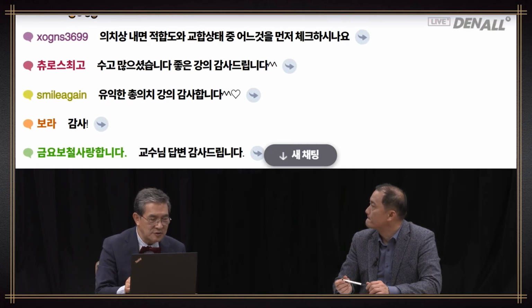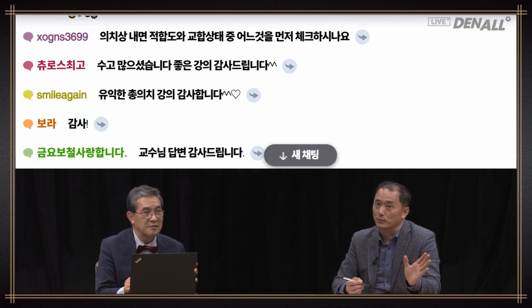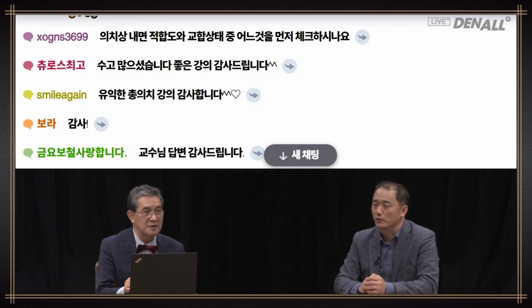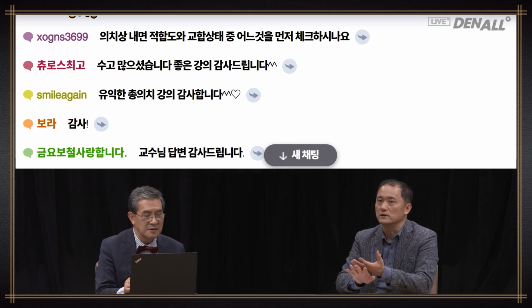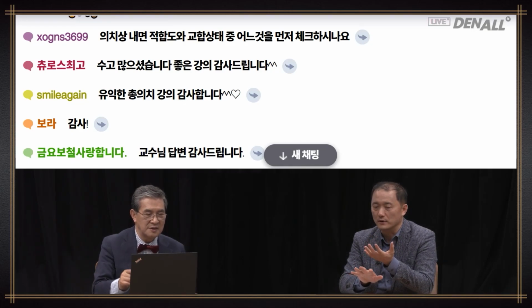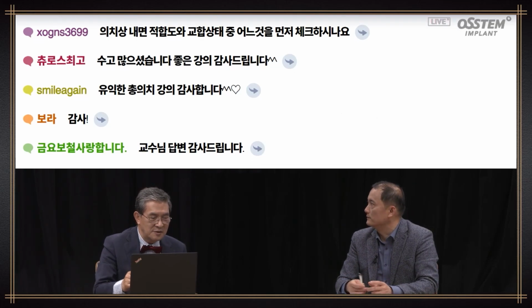Okay, then the next question is internal fitness and occlusion of the denture. What needs to be checked first? If it's an old denture, then fitness is something you look at first, whether it's okay, and then you look at occlusion. So denture occlusion is important, but occlusion is not always the first thing. First, if the fitness and support are really good, then you could check the occlusion status.